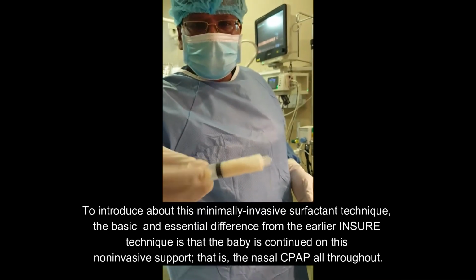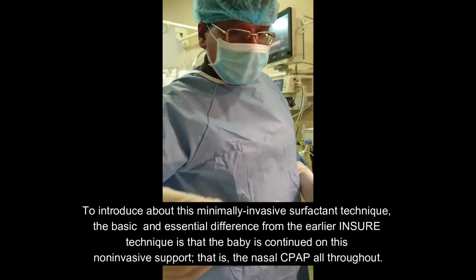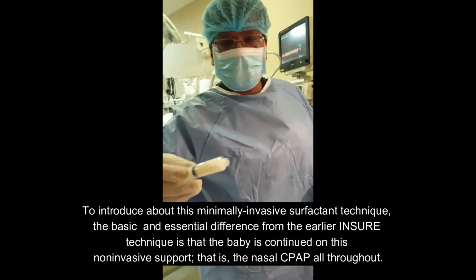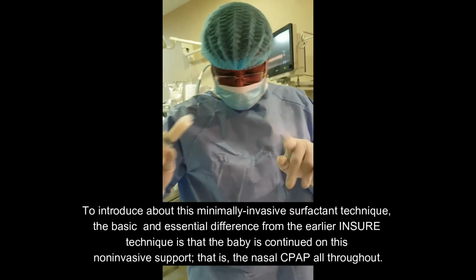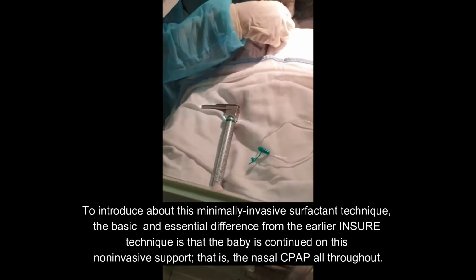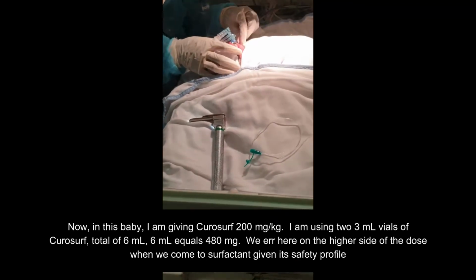To introduce this minimally invasive surfactant technique, the basic and essential difference from the earlier INSURE technique is that the baby is continued on this non-invasive support, that is the nasal CPAP, all throughout.